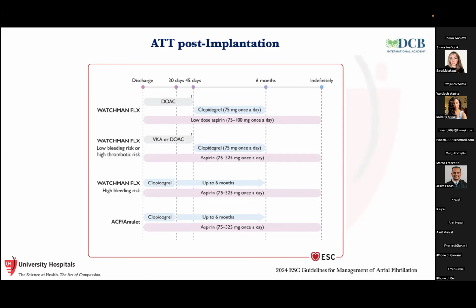We did a study with the Fondazione a few years ago with a very small, limited number of patients, less than 50 LAO, but in many cases we gave single antiplatelet from the very beginning, and they went well. We had a 6-month echocardiography surveillance which showed only one single case of device thrombosis that we managed with short-term anticoagulation, for a month, I think 1 or 2 months, and then we did another echo with resolution of the thrombosis.